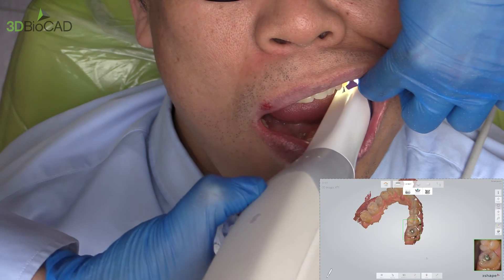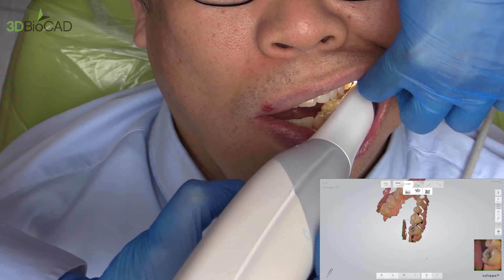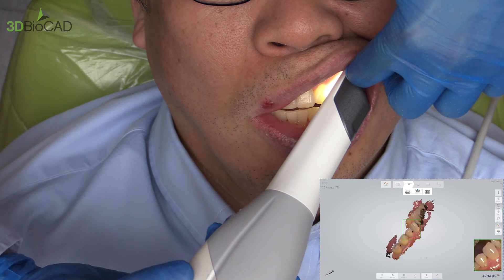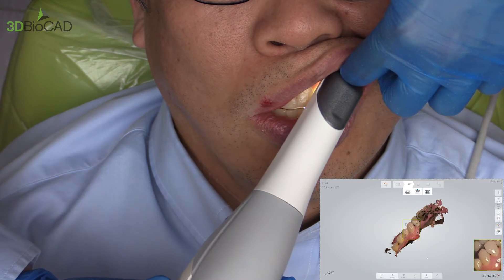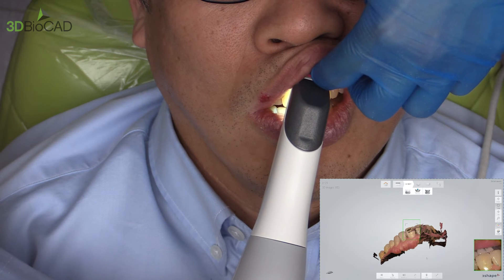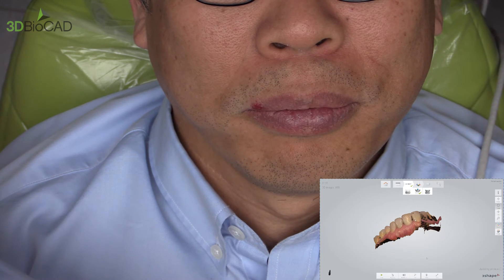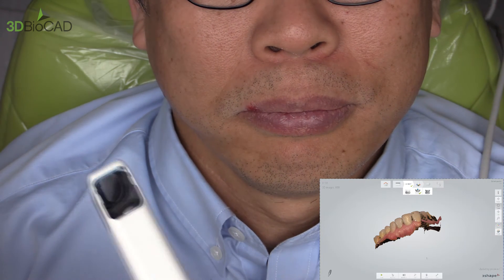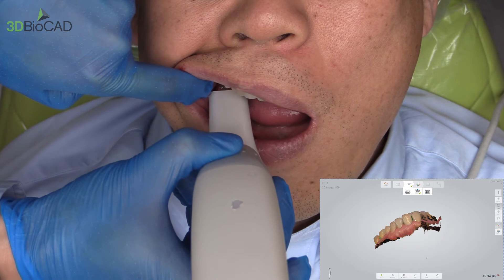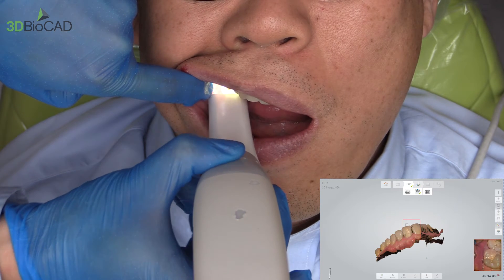As I turn it to facial, I have the patient close their bite — then I have much more space to put the scanner in. Make sure you're keeping it parallel to the surface that you're scanning, and make sure the scanner tip isn't touching the patient's tissue area, otherwise it's going to really hurt the patient. I stop here, have the patient relax and swallow, then go back to the other side of the terminal molar. The computer is good at auto-capturing where I'm scanning again.